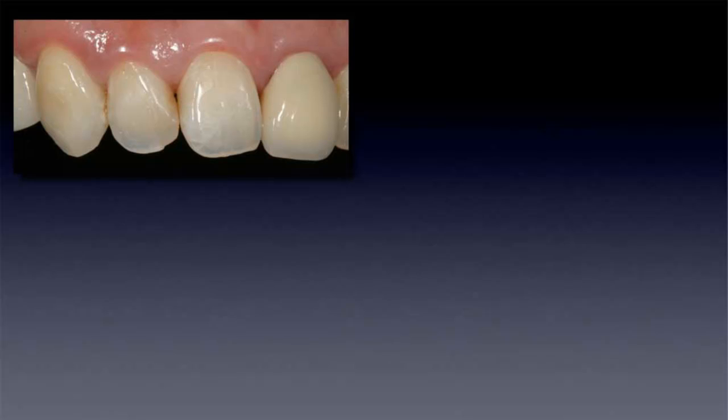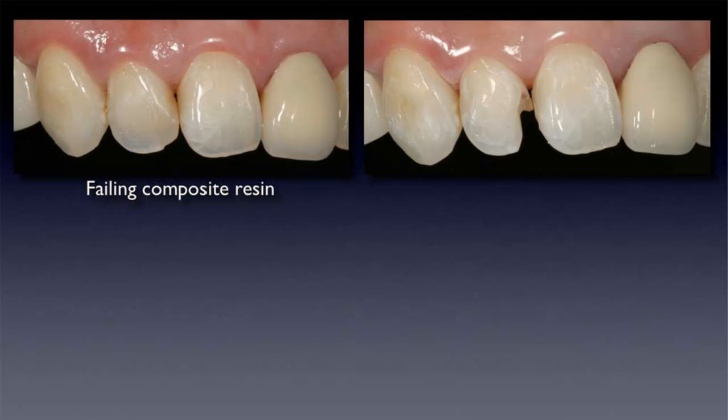So these 3 teeth that we'll be restoring. And we have some failing composite resins. So I'm taking out the composite resin, and this is what's left. We want to reinforce the fractures along the surface. We have a class 4 here. And then we're taking out this old facial composite and going to replace it with a new one.